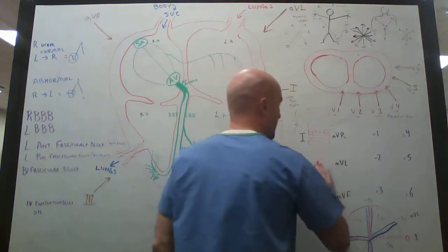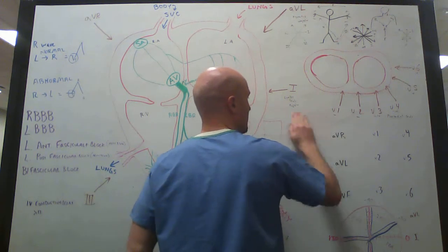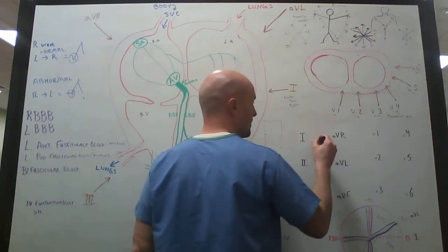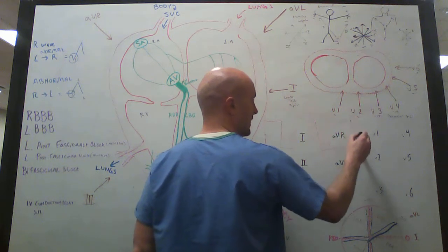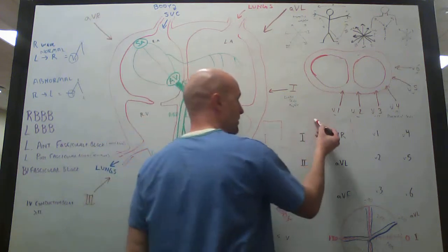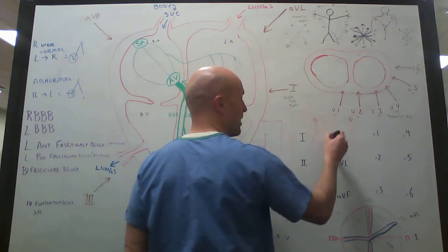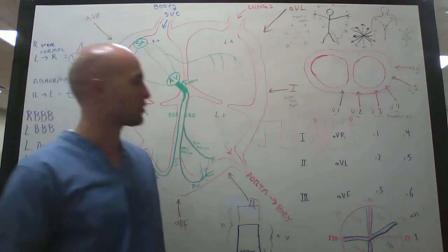Now what we're going to look at on our EKG reading is being able to count it. When we want to count this, we essentially have to go from a point until it repeats and gets to that point again. Of course this isn't to scale or anything. The easiest way to do this is to count from point to point. However many boxes across is going to give me an indication of how many beats per minute there are.